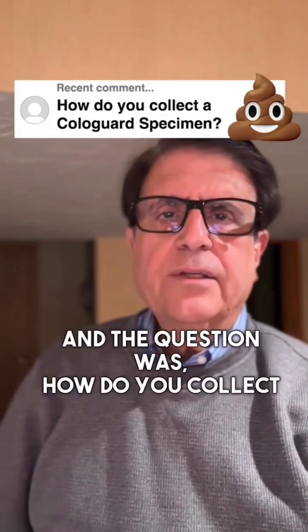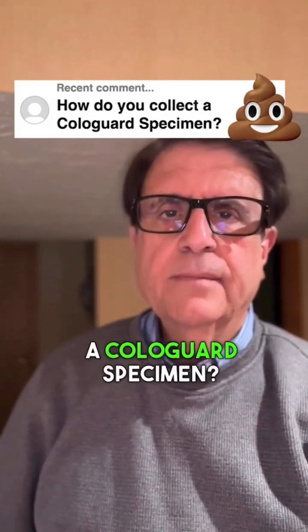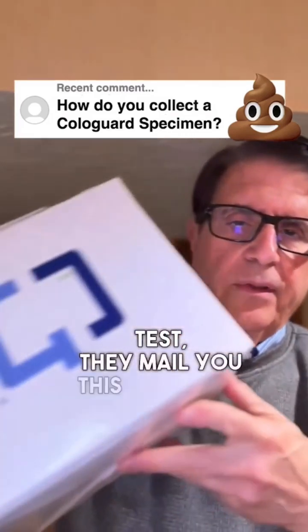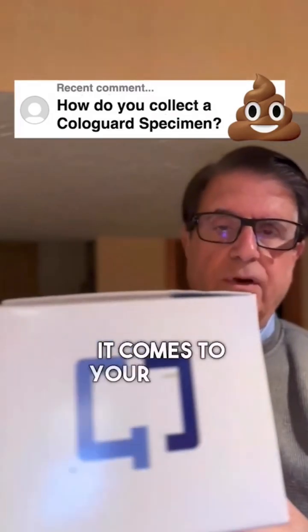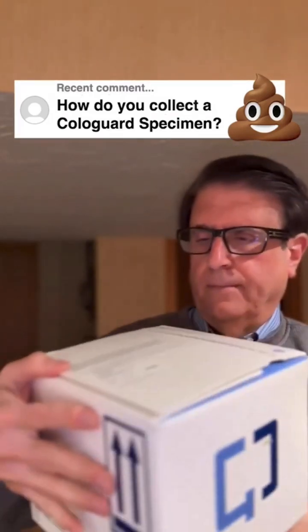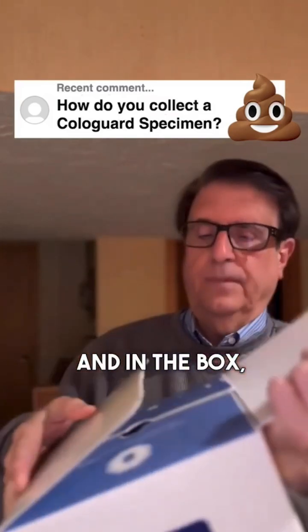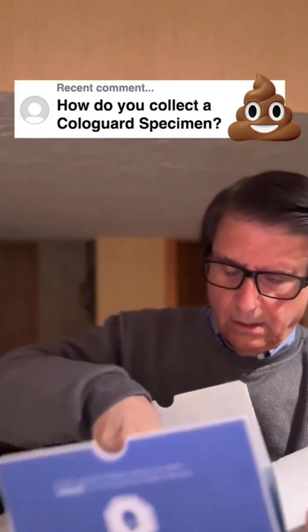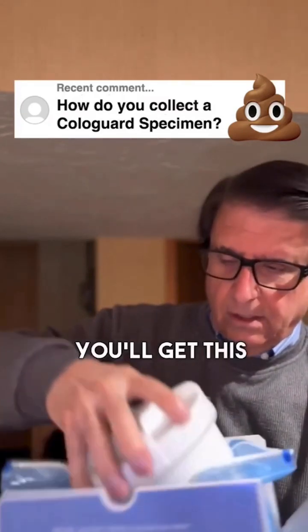The question was: how do you collect a Cologuard specimen? Well, when your doctor orders a Cologuard test, they mail you this giant box — it comes to your house — and in the box, after taking some of the packaging out, you'll get this container.